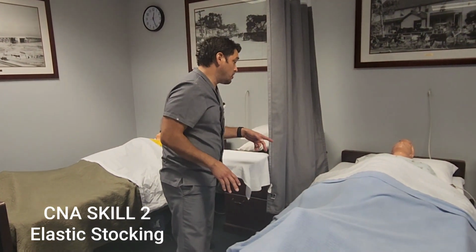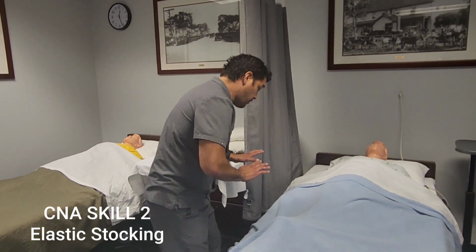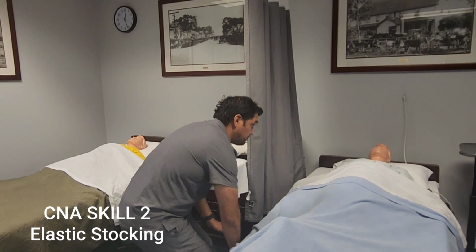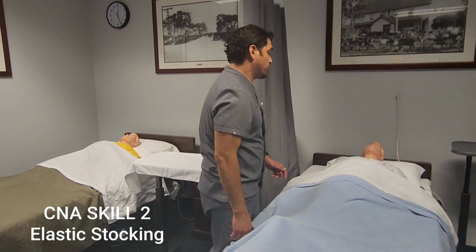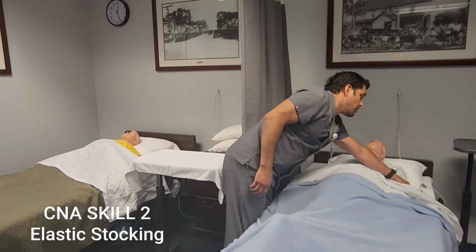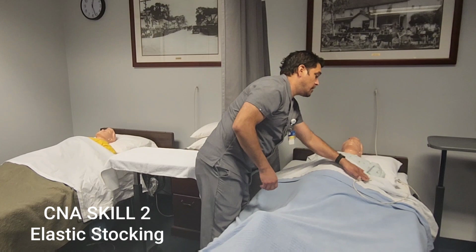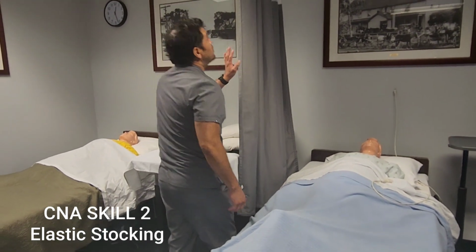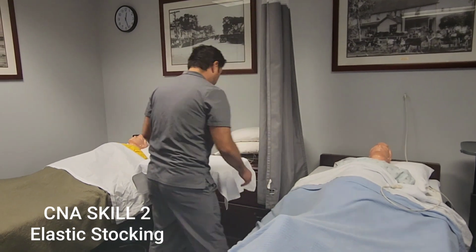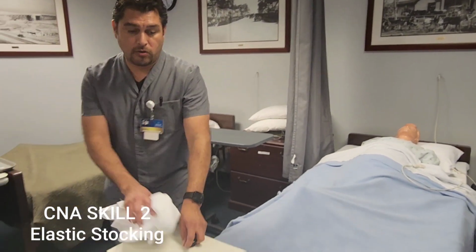I'm going to ask Mr. Jones, real quick, I'm going to lower your bed so that way your bed is at its lowest position again. Are you comfortable? Yes, you are? Okay, that's great. I'm going to make sure that your call light is within reach. So now if you need anything, you alert me, okay? All right, very good. I'm going to go ahead and open the curtains. I'm going to get my barrier. I'm going to place this in my soiled linen container.